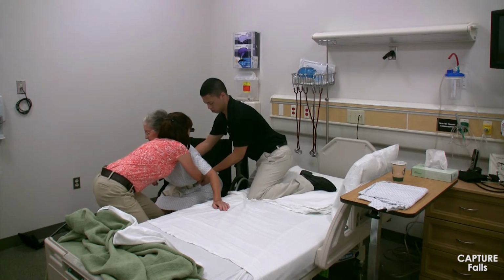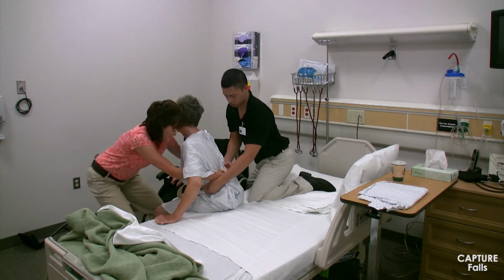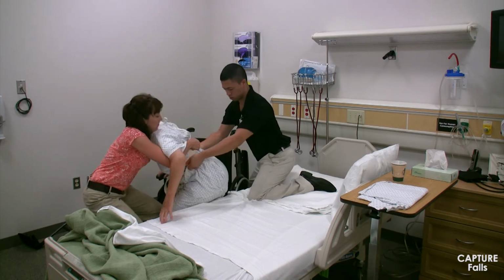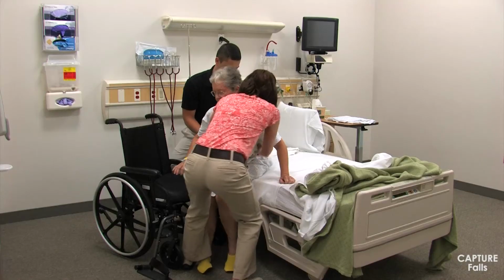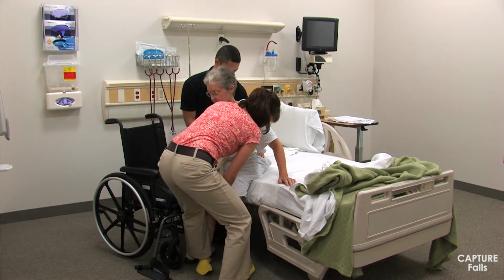The second person who is assisting should primarily help direct the patient towards the bed. He may provide some upward assist to help clear the patient's hips off the chair. His assist in the upward and lateral directions should make the pivot easier for the caregiver in front. You do not need to pivot all of the way into the bed at once. This video shows how you might go part of the way, reposition the patient's feet so that they don't get twisted, then complete the movement onto the bed.